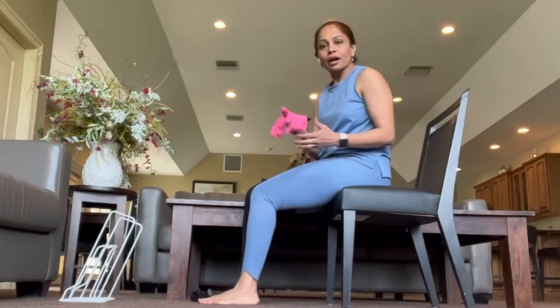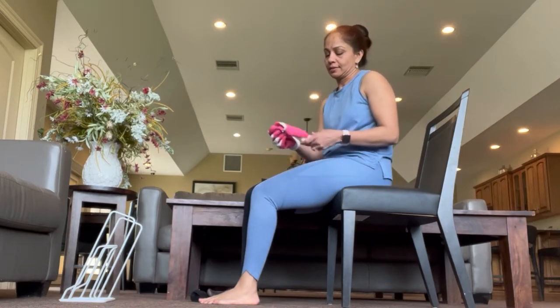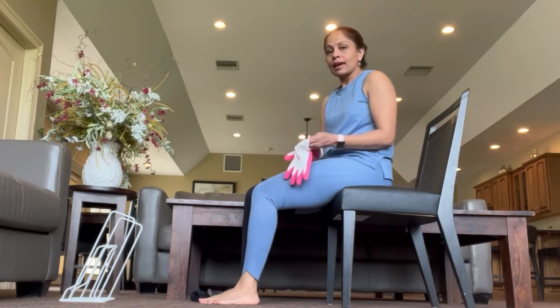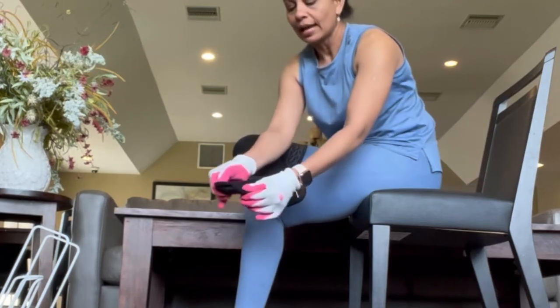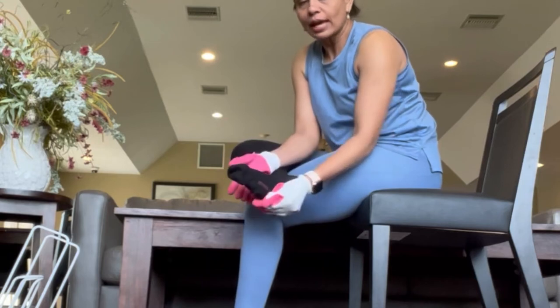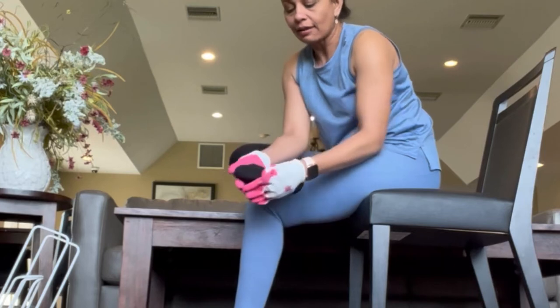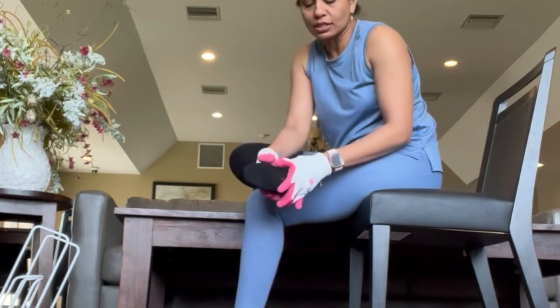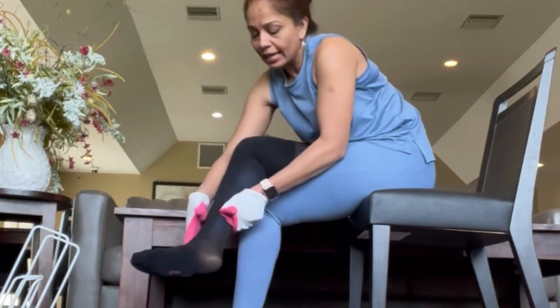I know it doesn't look perfect at this point — no worries, your garden gloves will come in handy. Put your gloves on, then cross your foot over and start working with your toes. You don't have to pick at it — just slide your hands and find where the fabric is supposed to sit.